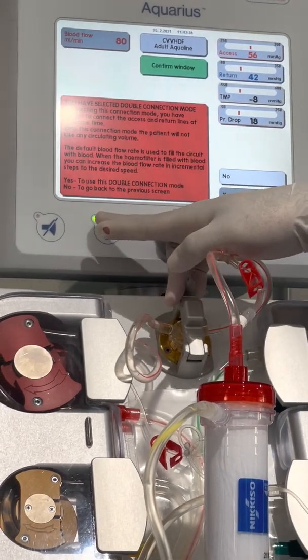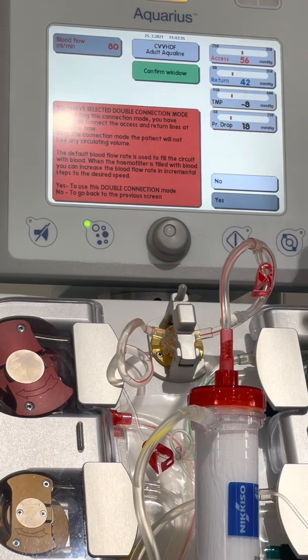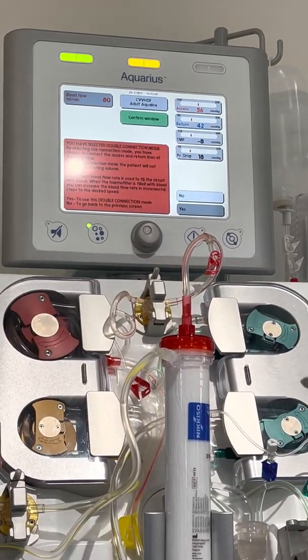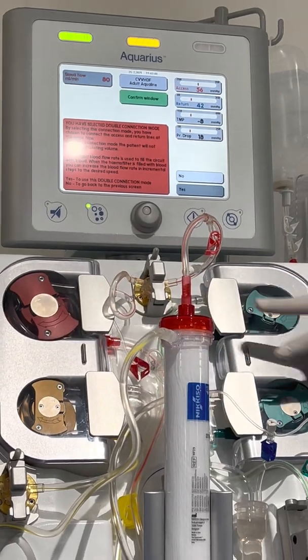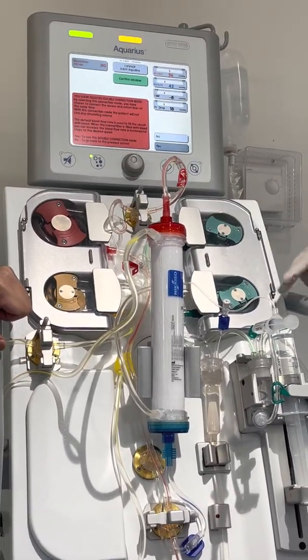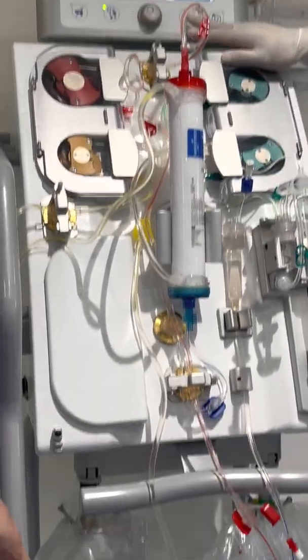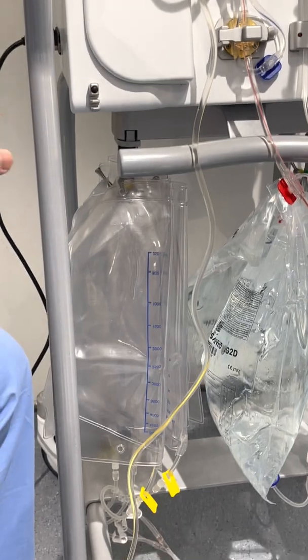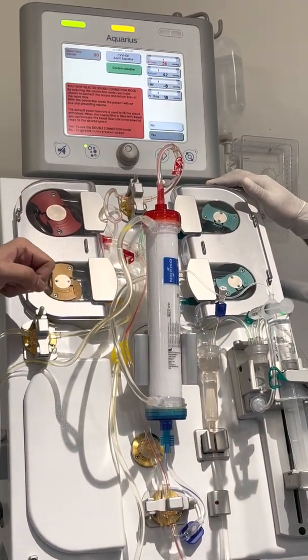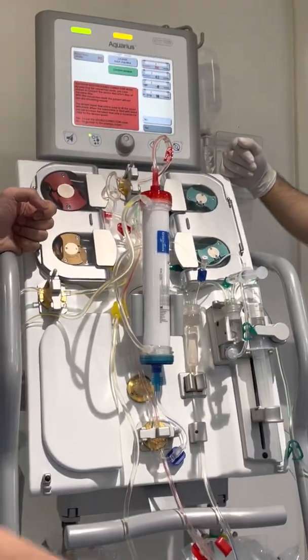Make sure that the green is solid, not blinking. If it is blinking, it means it's not running, and you will see that the dialysis will not work. If it is consistent like this, it will work. So you need to press here and then balance, clamp, remove, change, then press again. And make sure to change it to make it 4 again. So you put the 4 settings here. Same concept with the other bags.